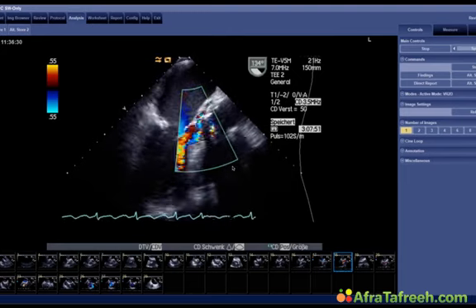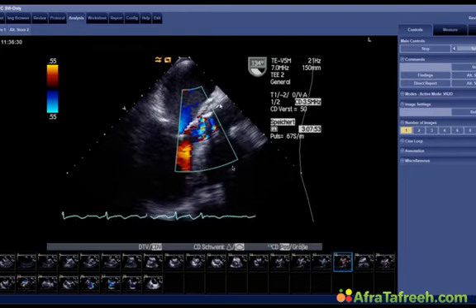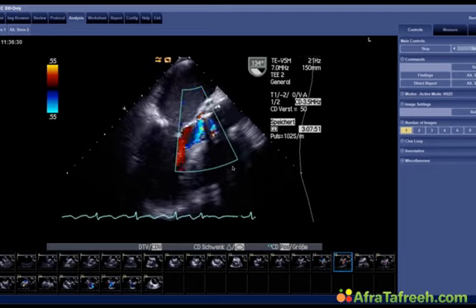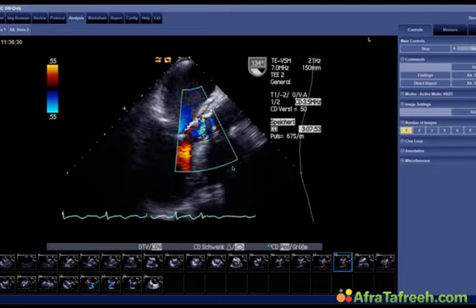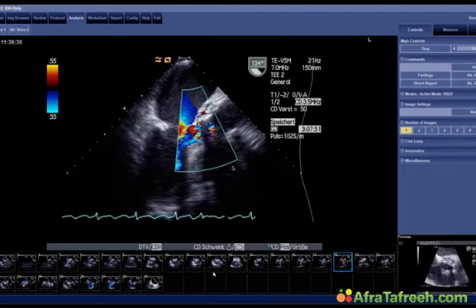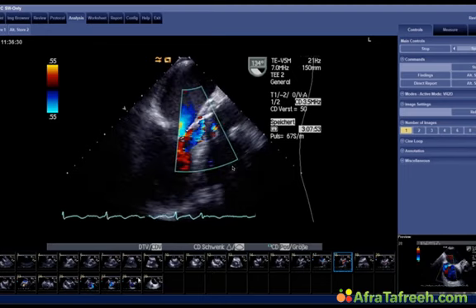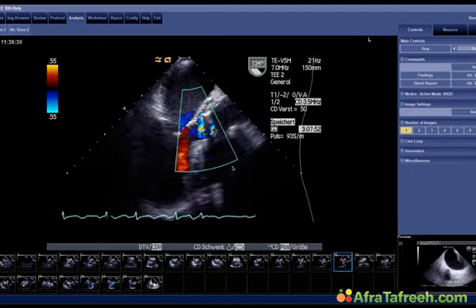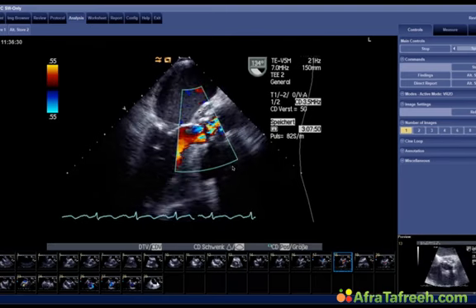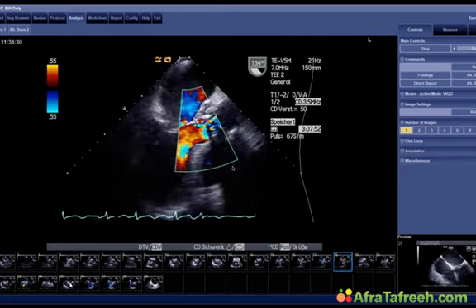So not only do we have endocarditis, but the additional information we have is that she also has a complication of endocarditis, namely abscess formation and also a pseudoaneurysm. So a very, very dramatic or severe finding. And this, of course, would mean that we probably need urgent surgery for this patient. I think you will all agree.